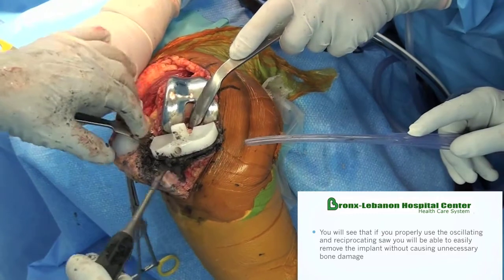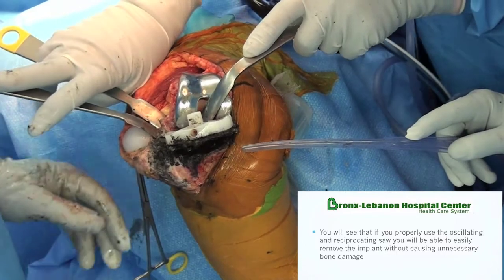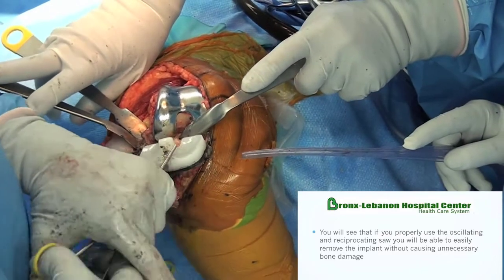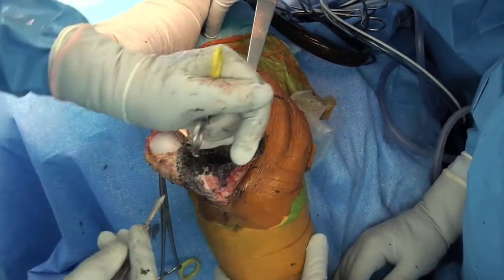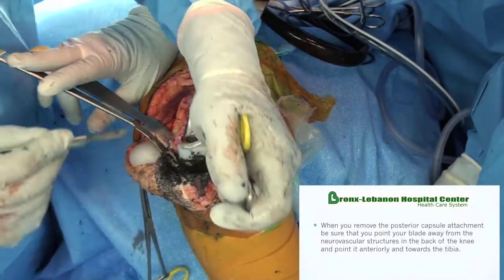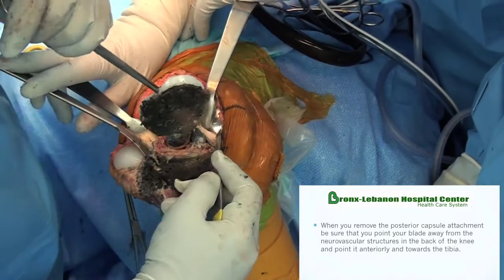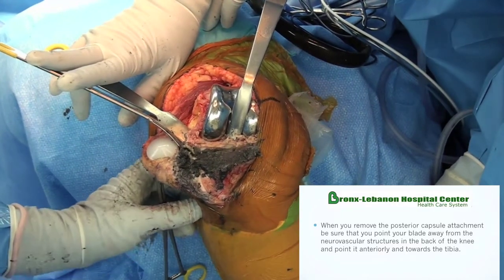You'll see that if you properly use the oscillating and reciprocating saw, you will be able to easily remove the implant without causing unnecessary bone damage. When you remove the posterior capsule attachment, be sure that you point your blade away from the neurovascular structures in the back of the knee and point it anteriorly and towards the tibia.